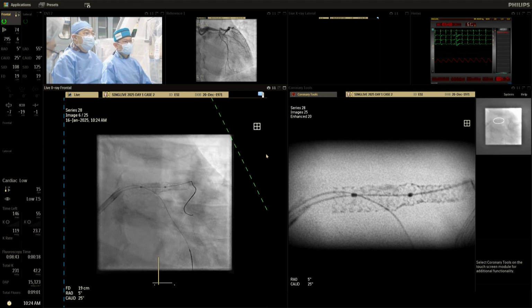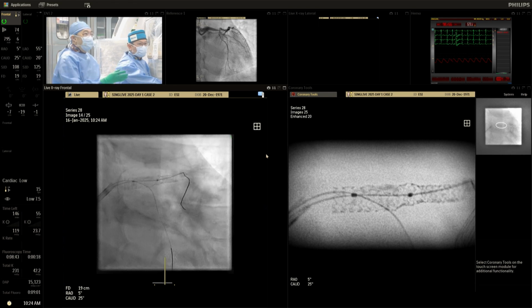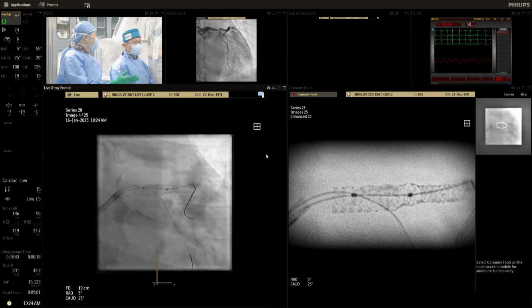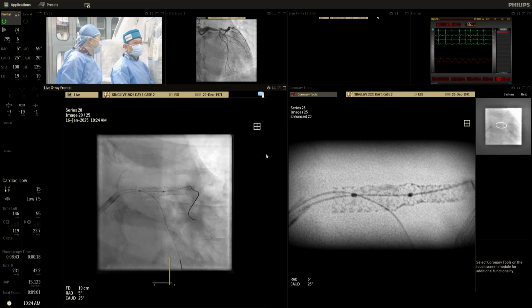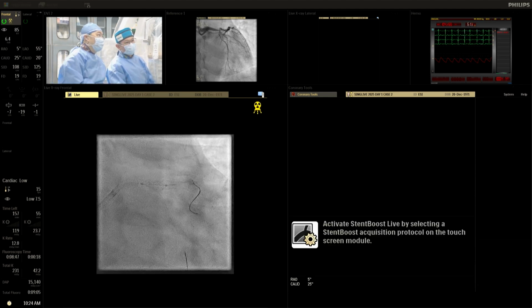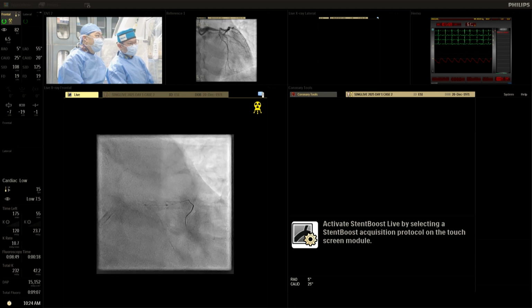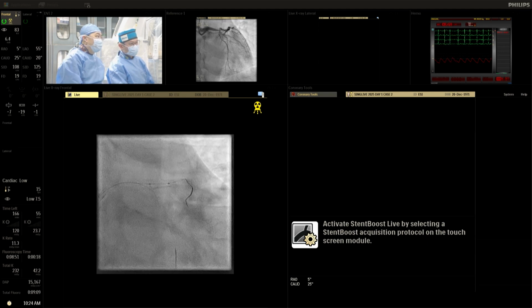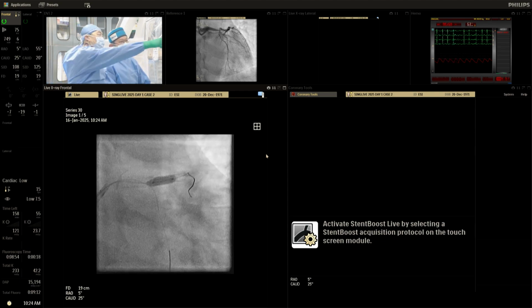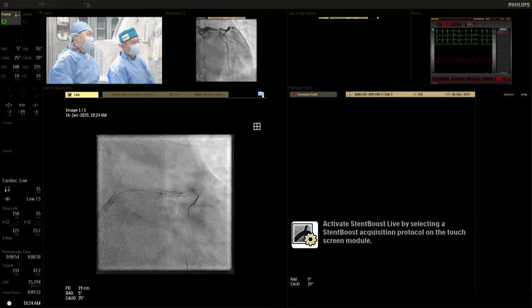I'm not sure whether doing IVL or rotablation will achieve a perfect result in this case either. With this sort of eccentric calcification, sometimes we just have to accept not an optimal stent expansion. Okay, we need the 4.0 to dilate the proximal to nominal, 12 and 14. Okay, down. One more dilatation at the bifurcation, higher pressure.